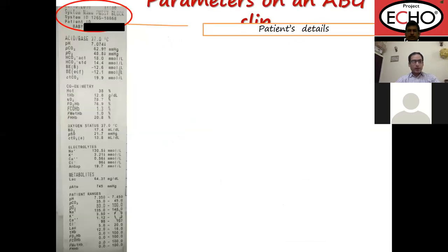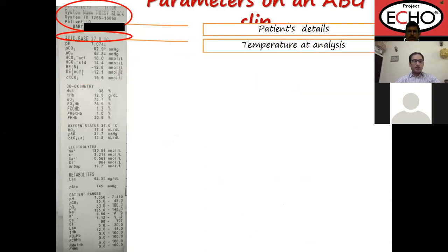Next. So a few things about blood gas. Normally it has multiple panels. The upper panel shows the patient details, that is the patient name, CR number, and the date. Then in the second panel, we have the temperature at which the sample was processed, followed by the commonly measured parameters. That is pH, PCO2, PO2, and bicarbonate, actual and standard.